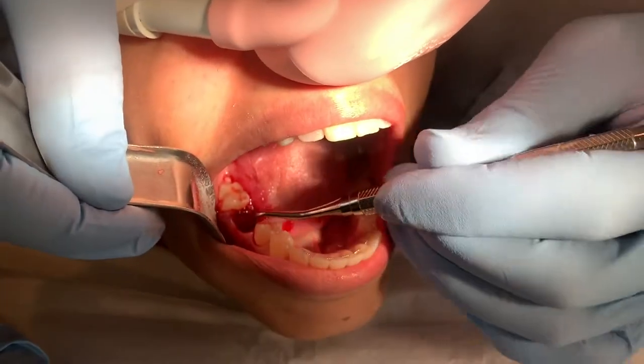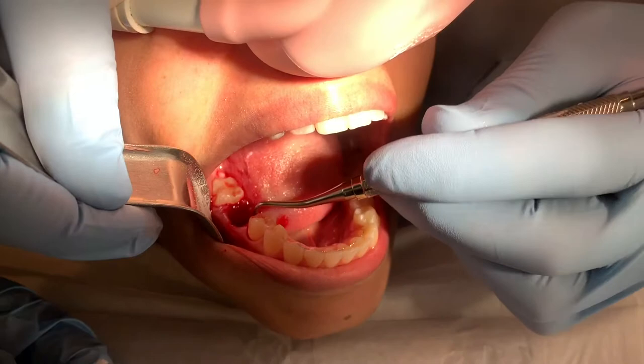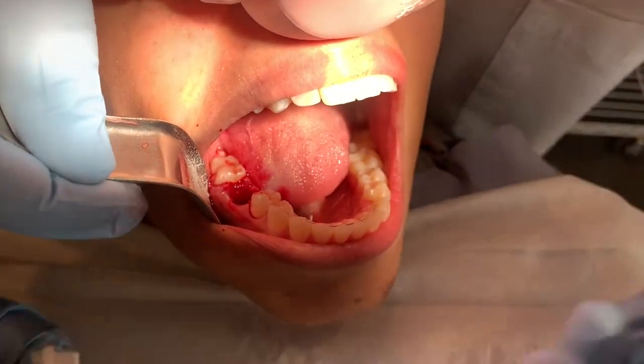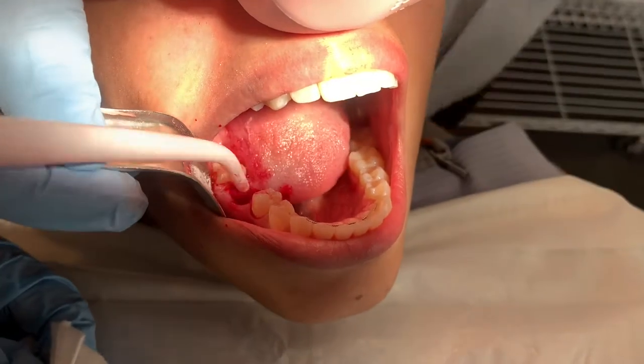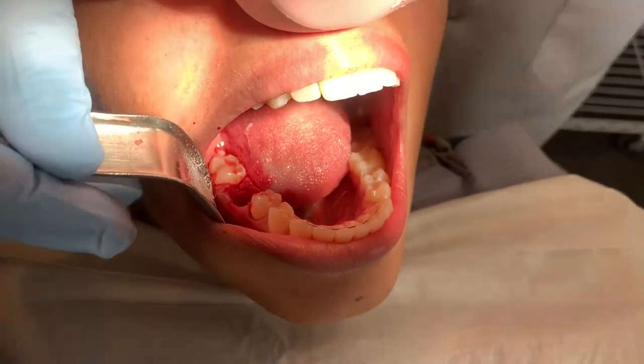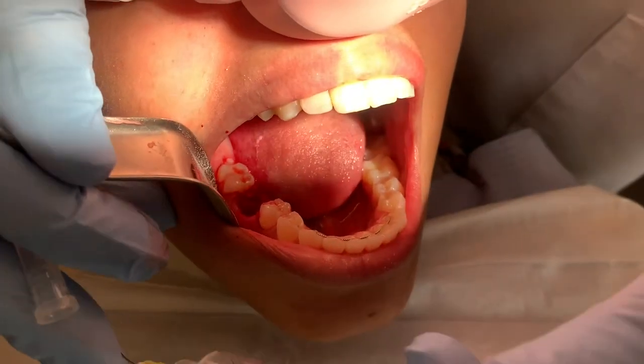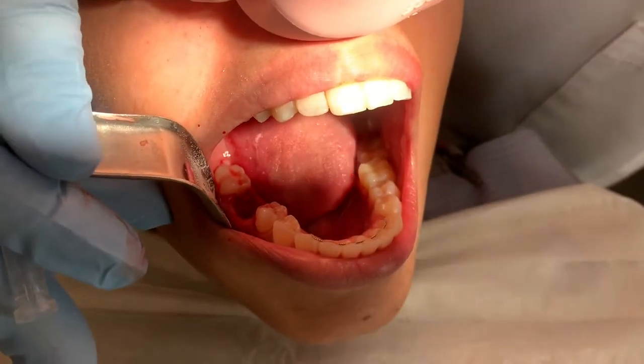There's not any scar tissue or cysts at the bottom of this area. That's much more common in root canal extractions. I have a video called How to Properly Remove a Root Canal Tooth that you can watch. There's a lot more going on with those teeth.